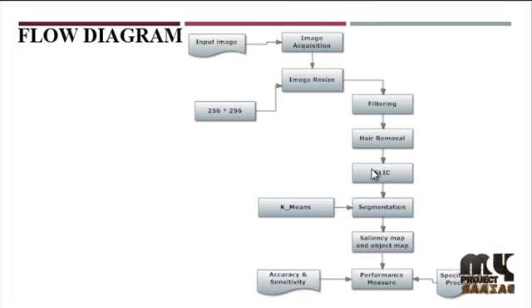A pixel with a higher gray level or another unique color quality, as seen in color images, will be shown in the saliency map in an obvious way. The objectness acts as a class-generic object detector. It quantifies how likely it is for an image window to contain an object of any class, such as cars and dogs, as opposed to the background classes such as grass and water.